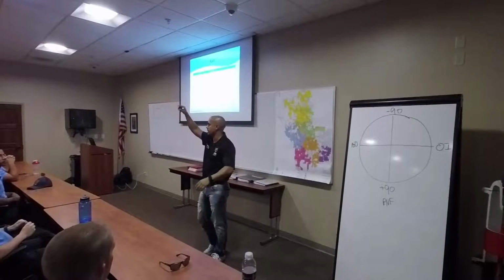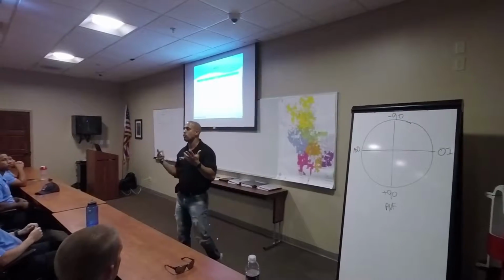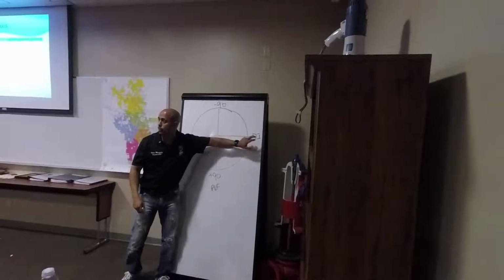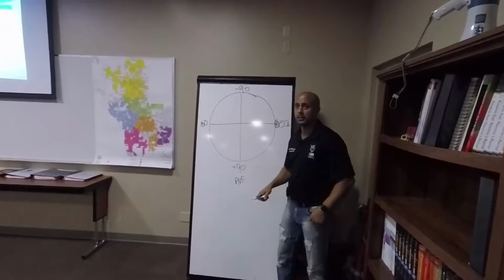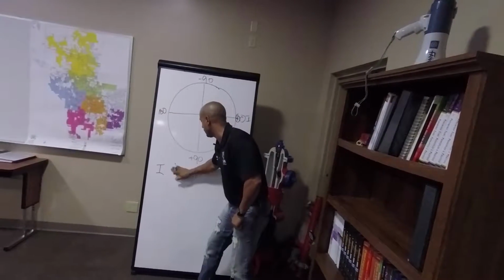P, the QRS, and the T. Look at that number. If you don't have it, that number, you can still identify it by using the 2 leads we've been talking about. What are the 2 leads? AVF and lead 1. So we know this is positive. We know that's negative. We know this is positive. Everybody with me?